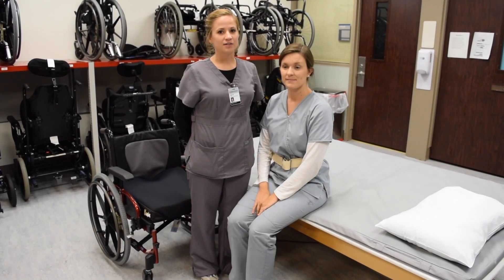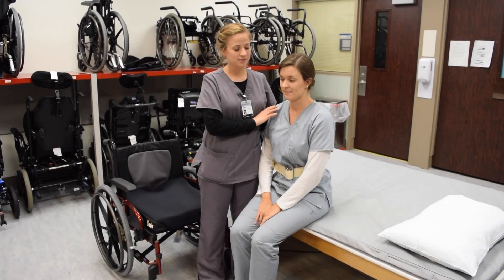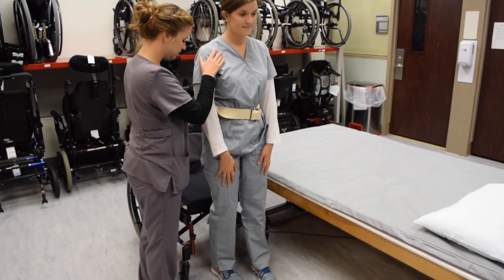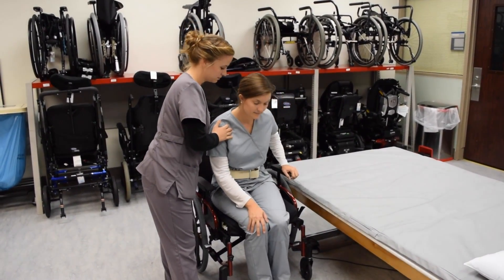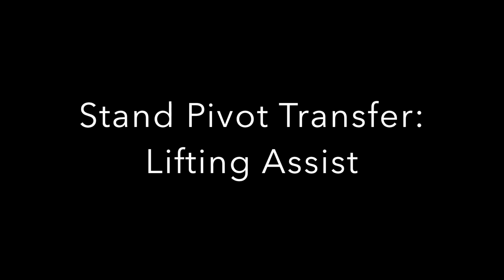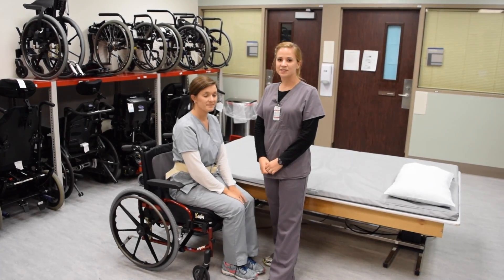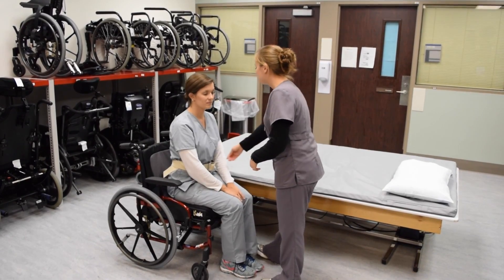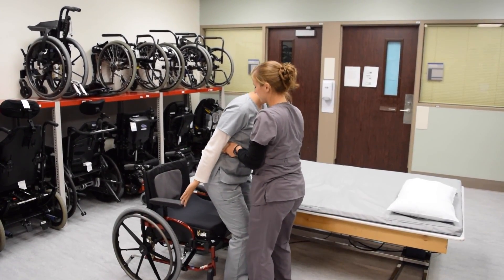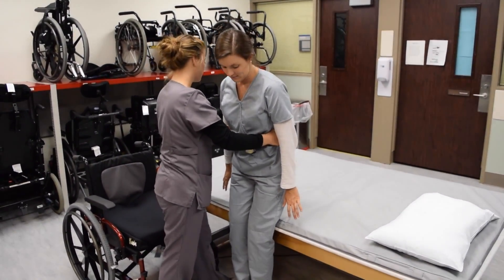For a stand pivot transfer, one hand will be on the back of the gait belt and the other hand will be free to guard the patient's upper body in case of loss of balance. Have your patient lean forward to stand up, turn and pivot towards the wheelchair, and reach back for the armrest before sitting down. In the event that some physical lifting assist is needed, you can position yourself in front of the patient with your hands on the side or back of the gait belt. Have your patient lean forward and push off of their chair to stand up, then pivot towards the mat and reach back before sitting.